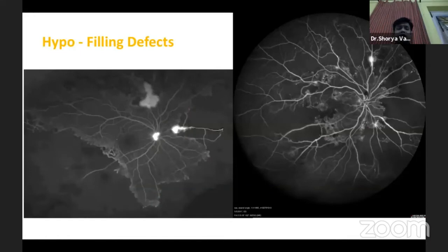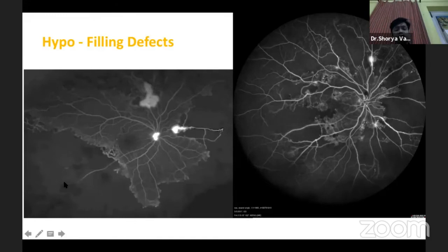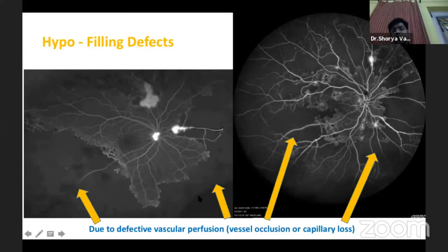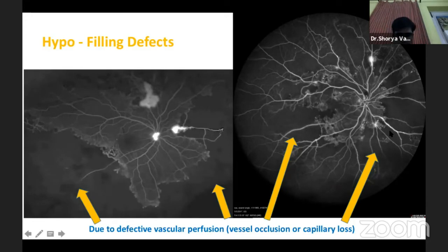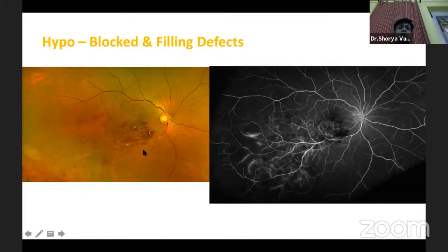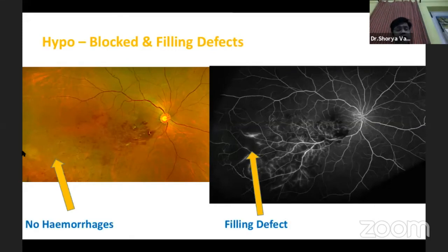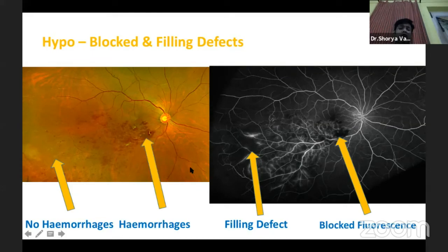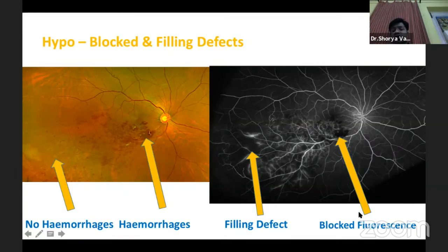The next hypofluorescence type is filling defects, which are non-perfusion areas. These are typically seen in vasculitis with peripheral capillary non-perfusion areas, and in diabetic patients where the capillary non-perfusion is more posterior. It is important to correlate with the clinical photograph: if there is no hemorrhage clinically but there is hypofluorescence on the angiogram, it is a filling defect. If there is a hemorrhage clinically corresponding to the hypofluorescent region, it is a blocked fluorescence.